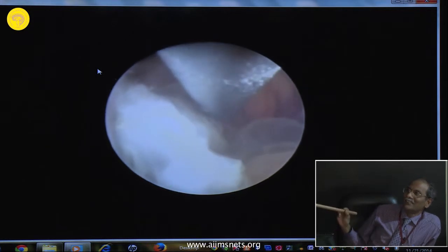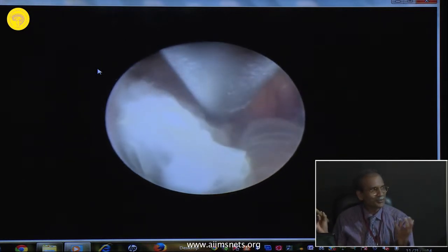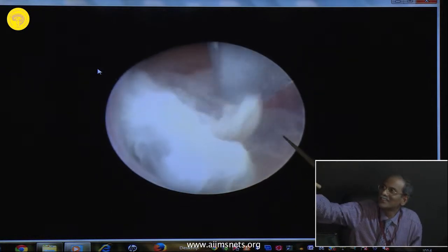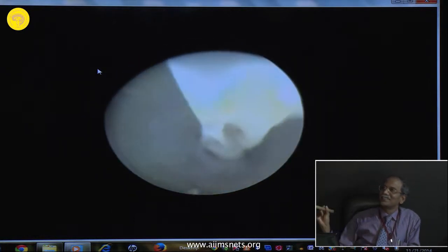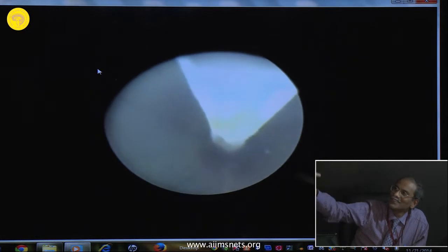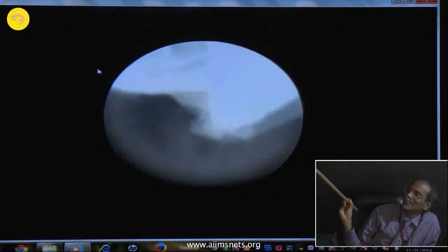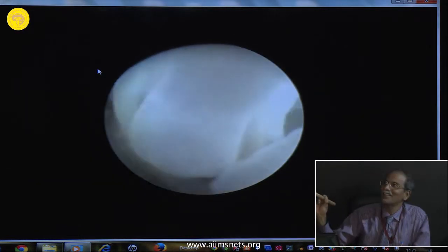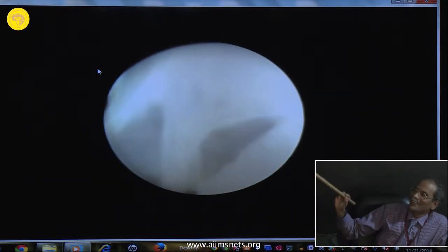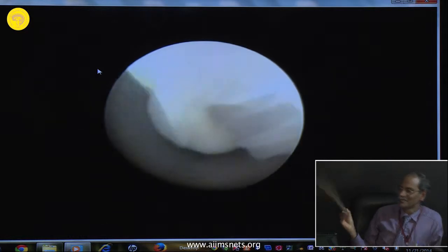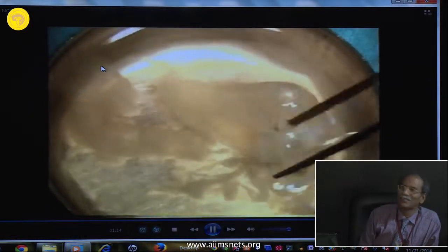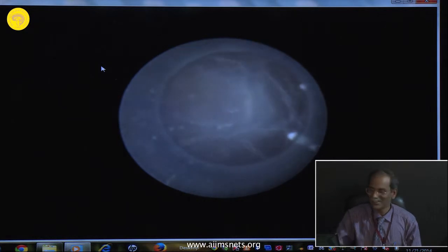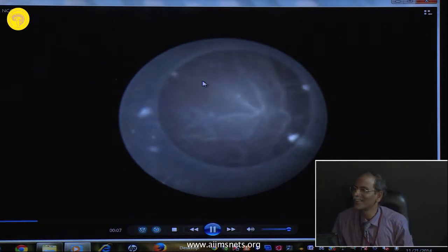When I was taking it out, the whole tube was blocked with the cyst wall. This is one another cyst — you can see the whole tube inside. It was attached to the cannula itself, so I brought out the cannula along with the cyst cavity. Then I placed it on the plate — see, so much cyst and such a dirty colour. The natural colour is dirty, but when it is inside, it appears so bright.